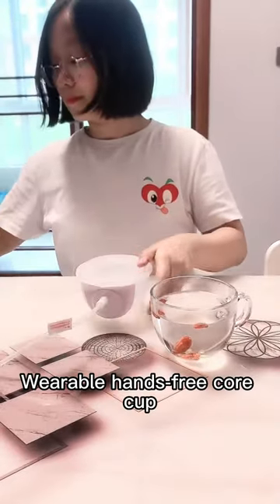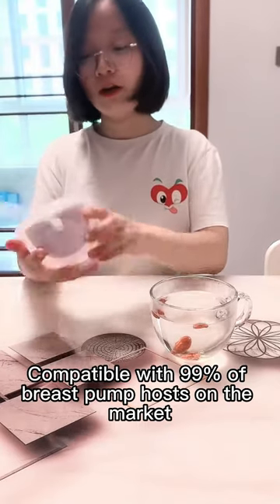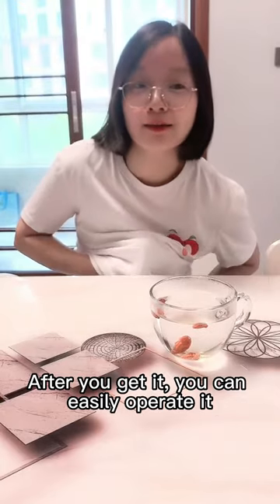Oh my god, is it so amazing — the wearable hands-free core cup, compatible with 99% of breast pump hosts on the market. After you get it, you can easily operate it.